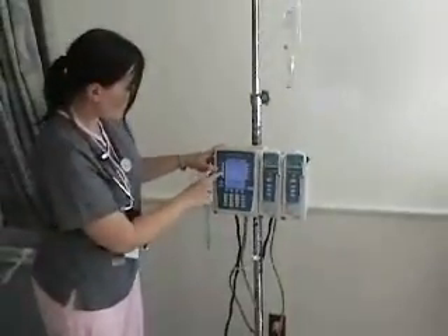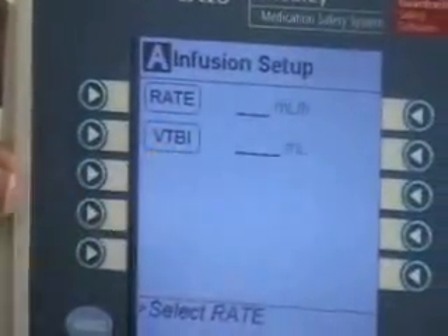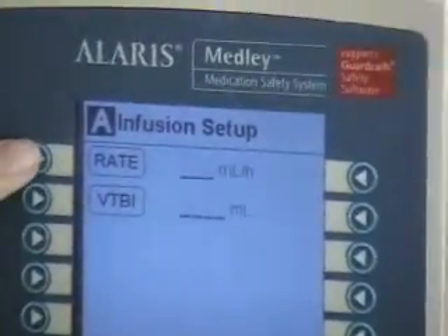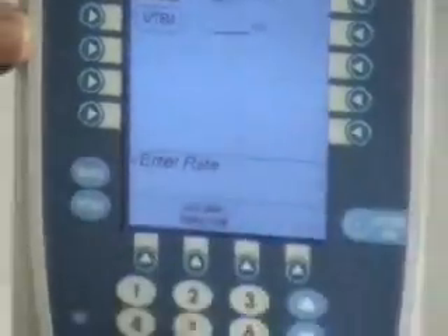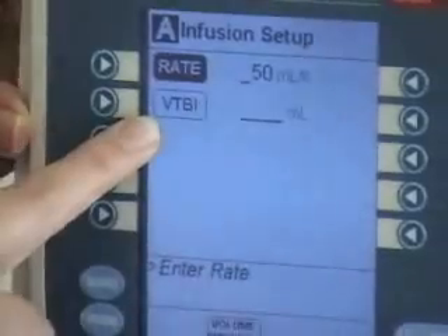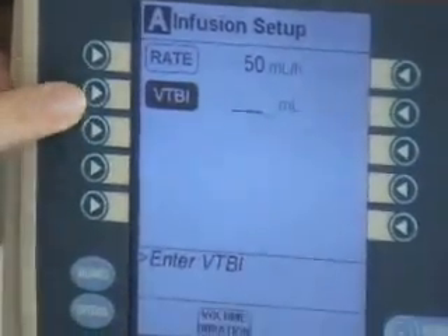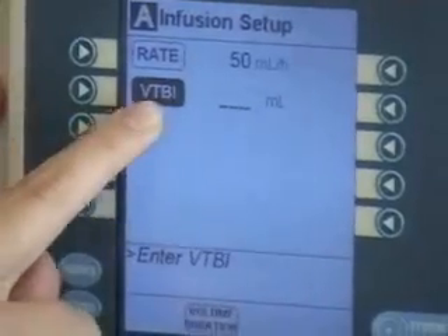We hit the basic infusion button, and it asks for the rate and volume to be infused. The rate we said would be 50 milliliters per hour. Then we have a volume to be infused button — these become highlighted as you press the side key, VTBI: volume to be infused.